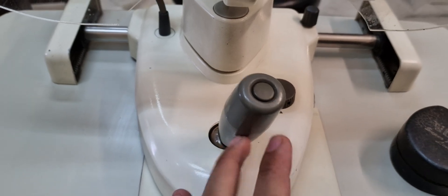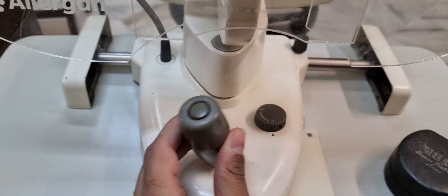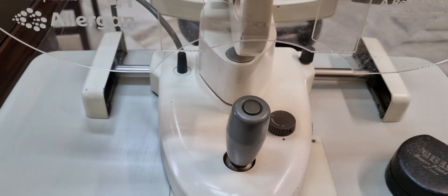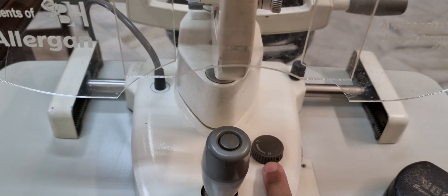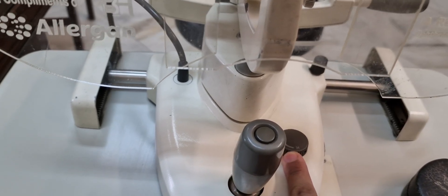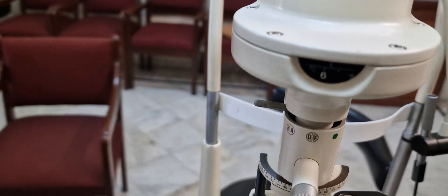There is a joystick that is used to move the slit lamp. This joystick moves the slit lamp upwards and downwards by rolling, or left or right, or forward and backward, so we can get a focused image. With this joystick, there is a light illumination control which can be adjusted high or low according to the comfort of the patient.